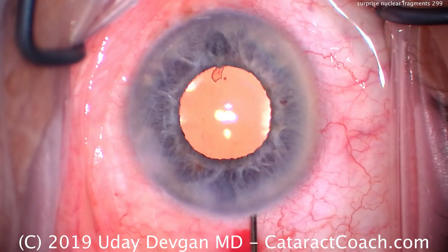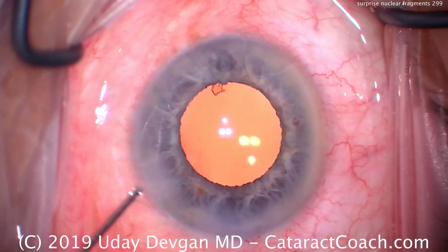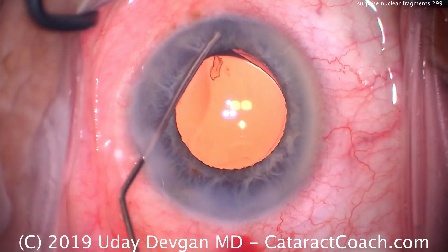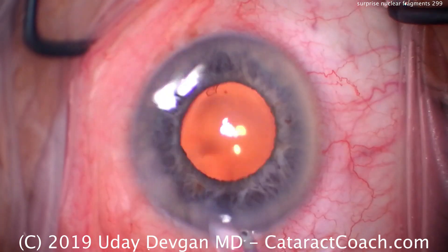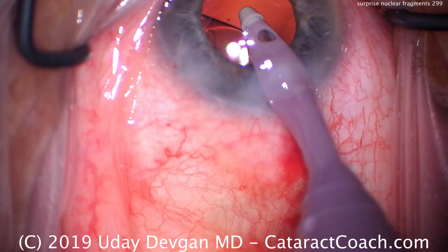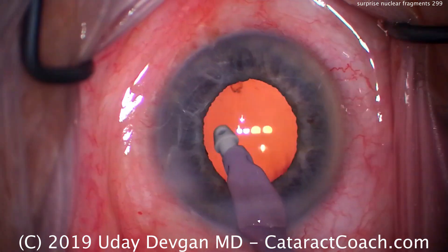So what we'll do here is seal up this incision a little bit. We're going to use that same IA handpiece in a bimanual method — irrigation in the right hand and aspiration on the left. Just trying to squirt BSS, it's just not getting that one piece, and I can't leave it. Right hand has just the infusion now, but we still can't reach it — there's just too much tension on the capsular bag by dislocating the lens to try to get underneath it.